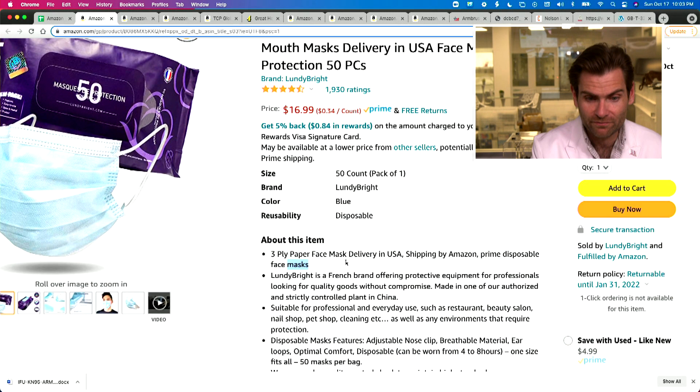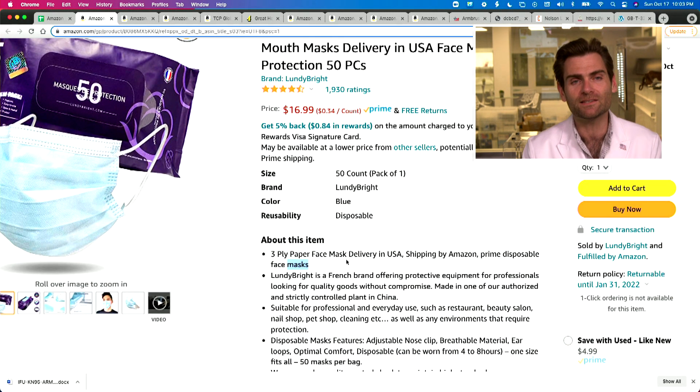Three-ply paper face mask — delivery in the U.S. I hate it when people think that these are made of paper. They're made of plastic, actually. This doesn't make any sense.